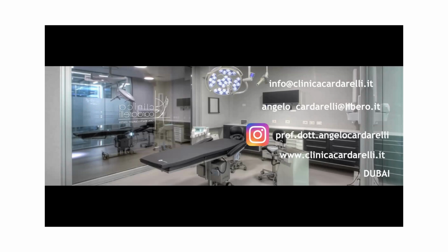I want to ask, do we have any osseointegration of the frame with the bone? We have the osseointegration for sure in terms of the screw. Regarding the frame, according to the latest publication, we cannot say osseointegration because, as you know, for osseointegration we need the implant to be inside the bone.